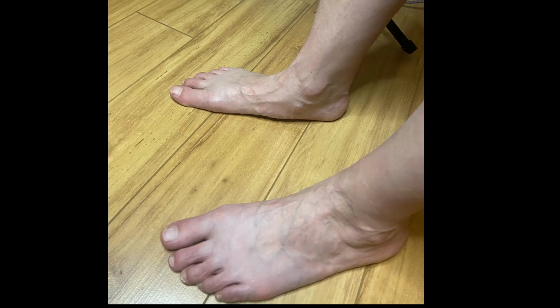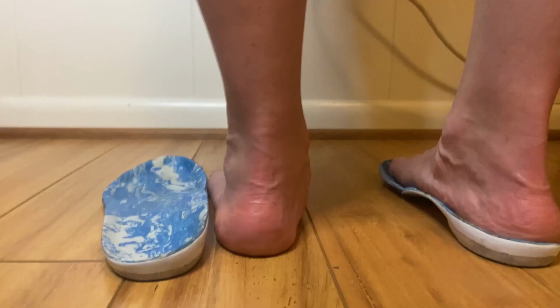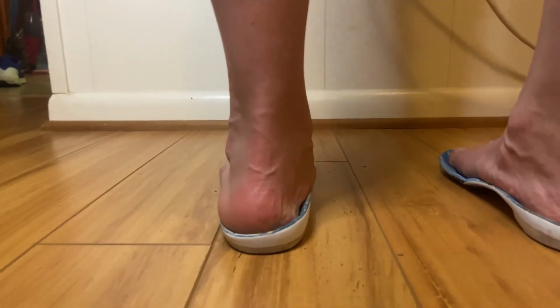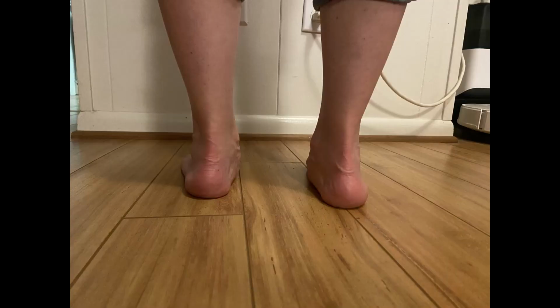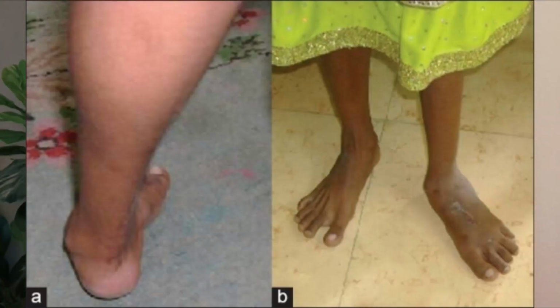For instance, I'll talk to you about one particular problem. This is my friend Krista. She has a very flat foot. You can see the upper foot there with the arch collapsed. Here's another view of it. So there's a lot of strain on the midfoot. Here's her outside of her orthotic, and you can see how she gets straightened up when she gets into her molded orthotic. Here's a before picture with her feet collapsed, and an after picture with her feet straightened up in her custom molded orthotic. A lot of these issues are structural and bony in nature, and then therapy just can't help that.